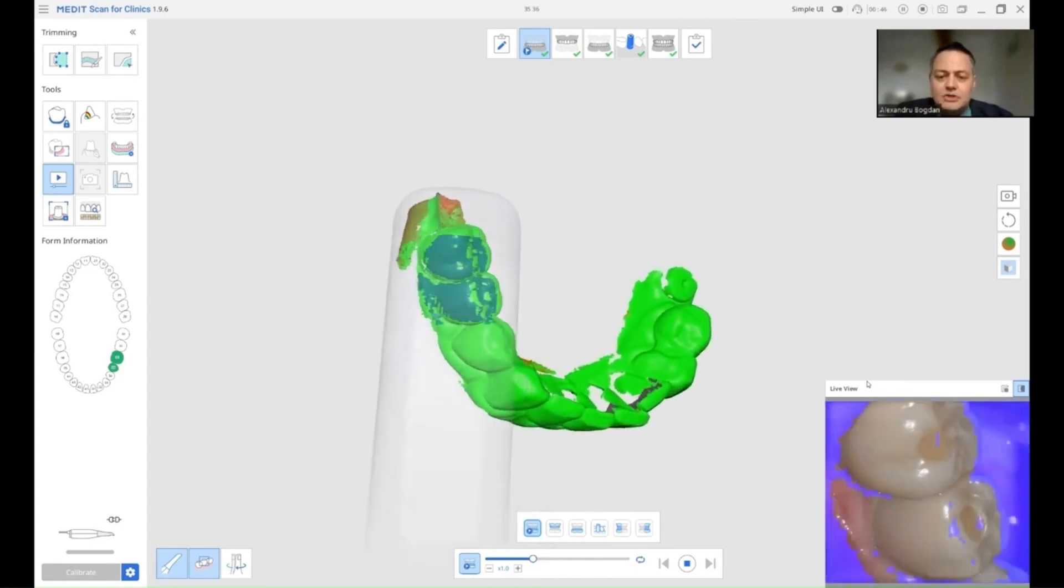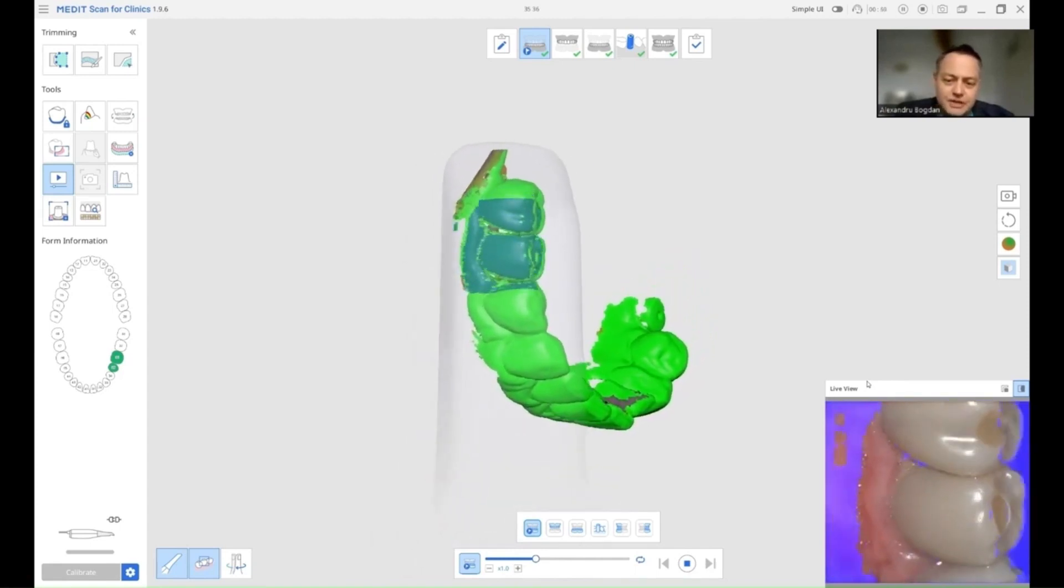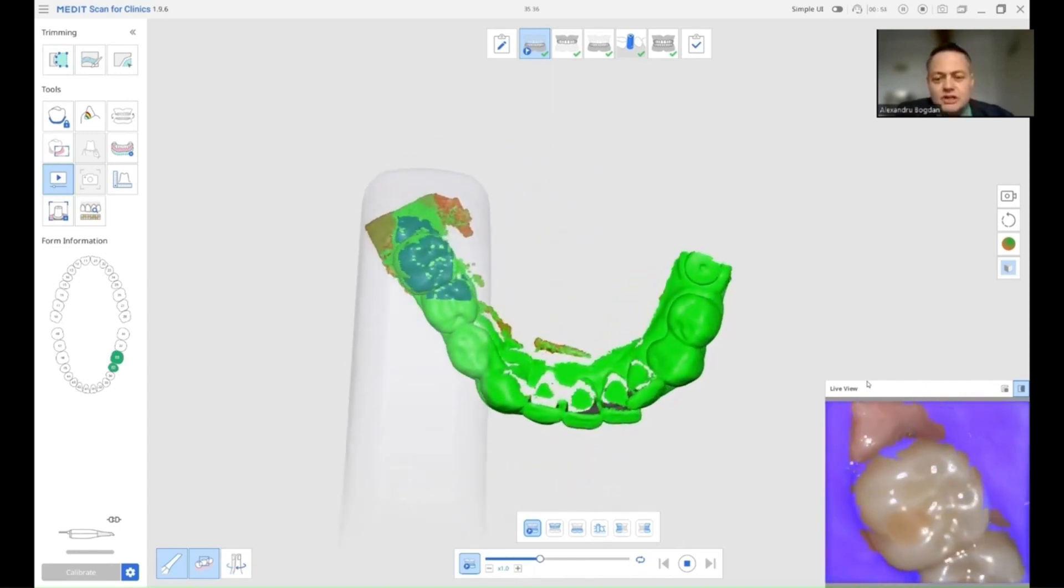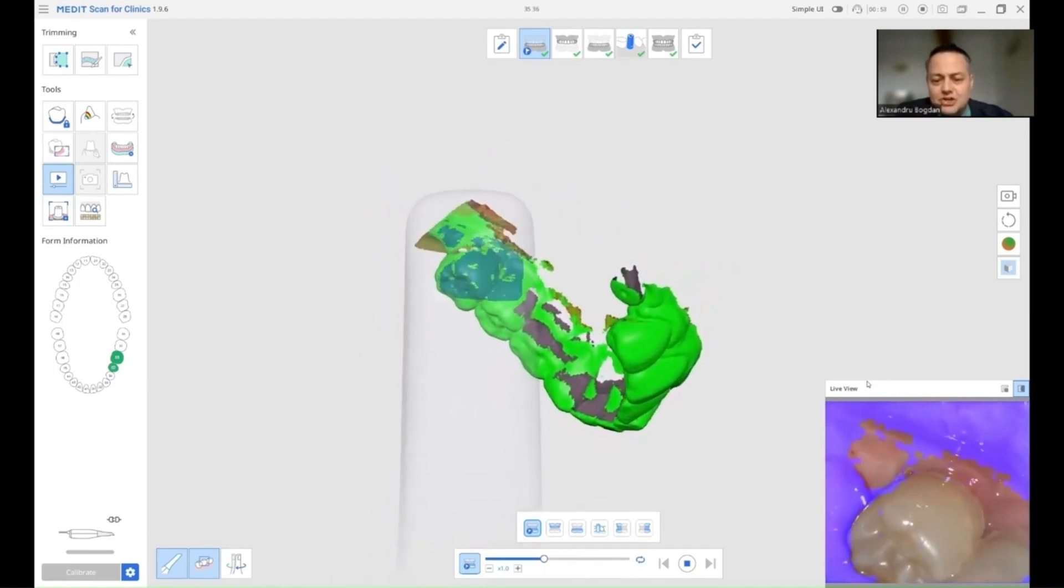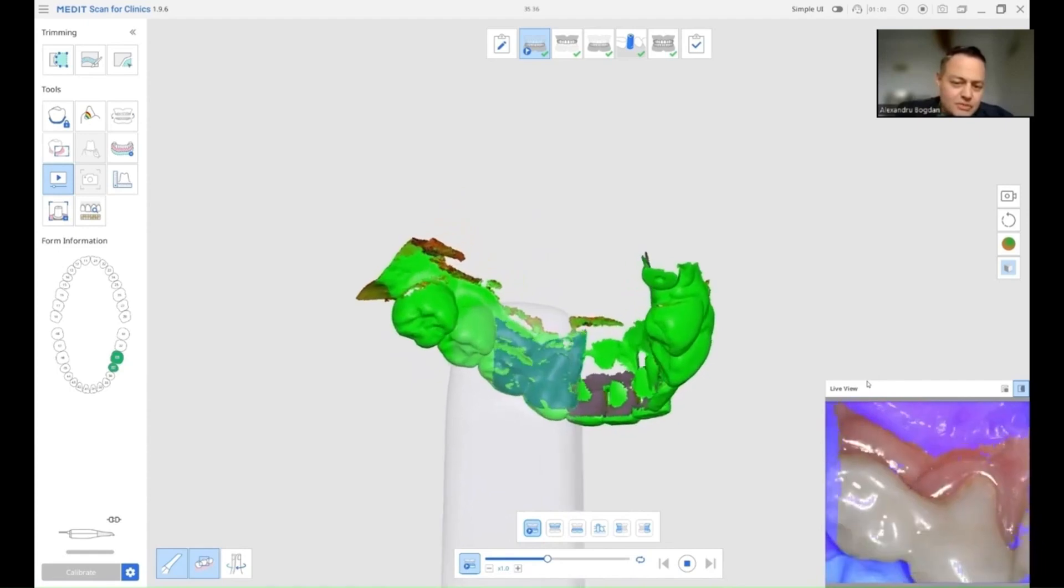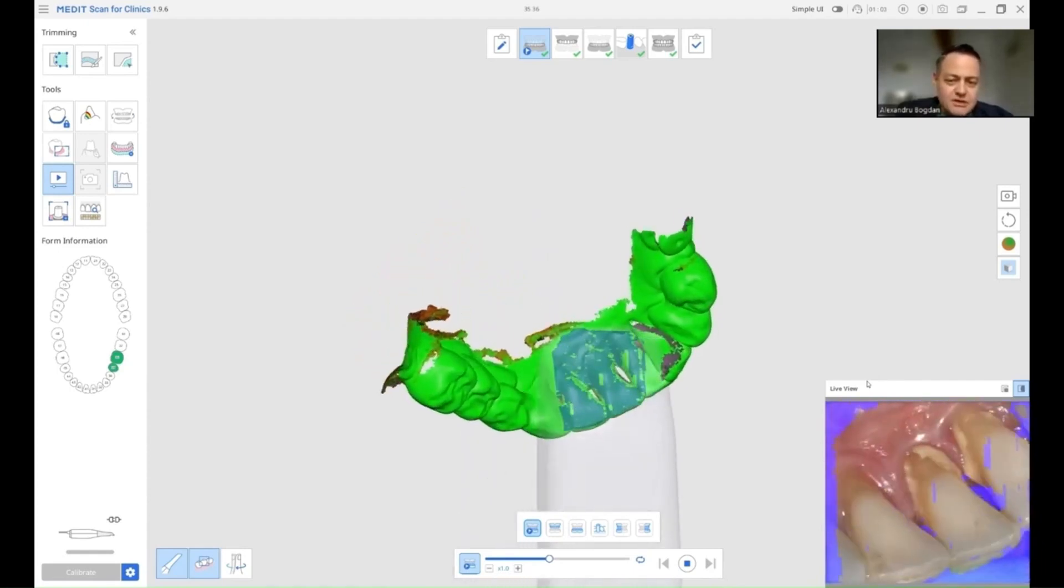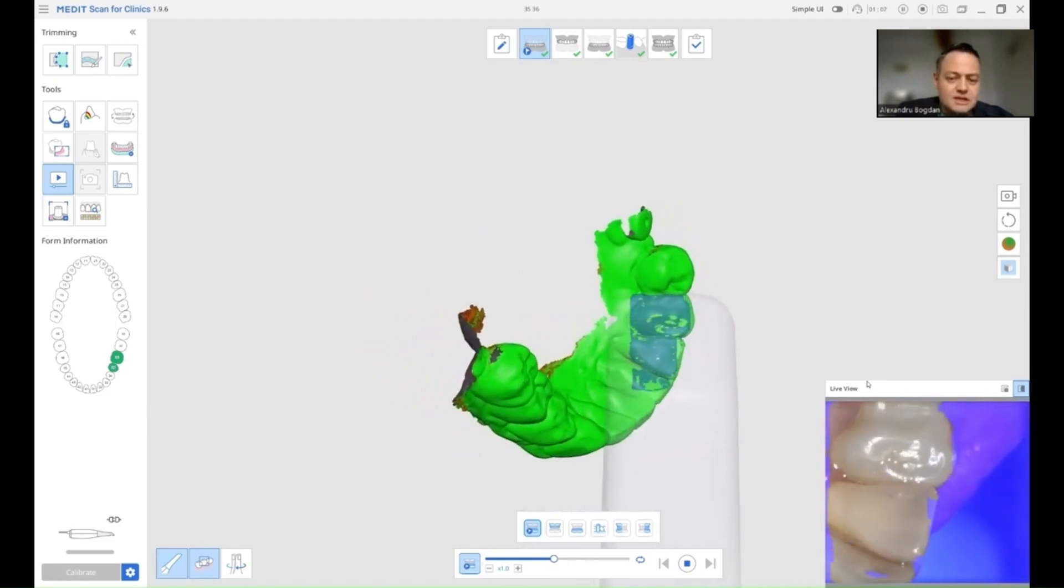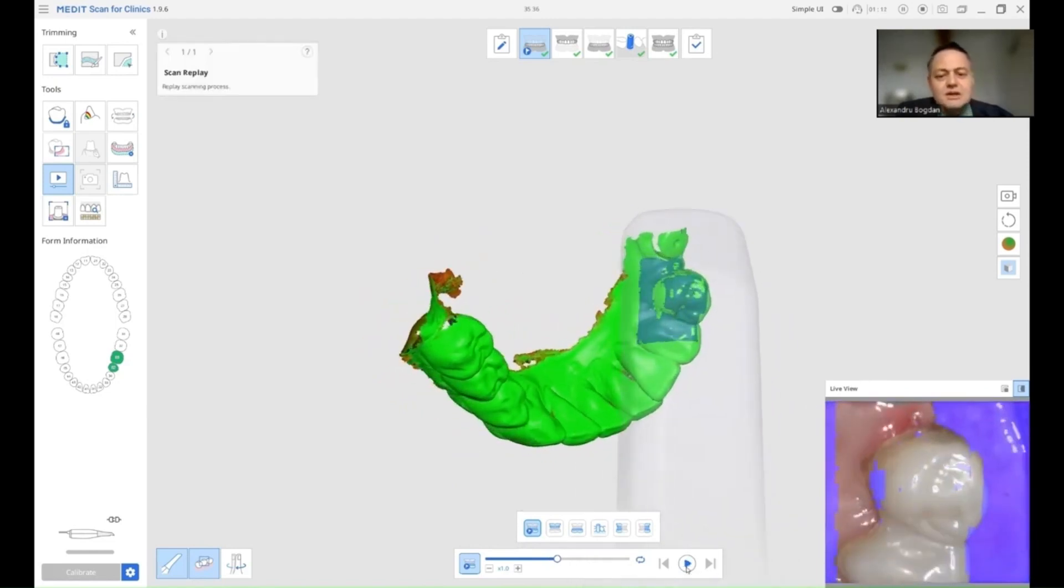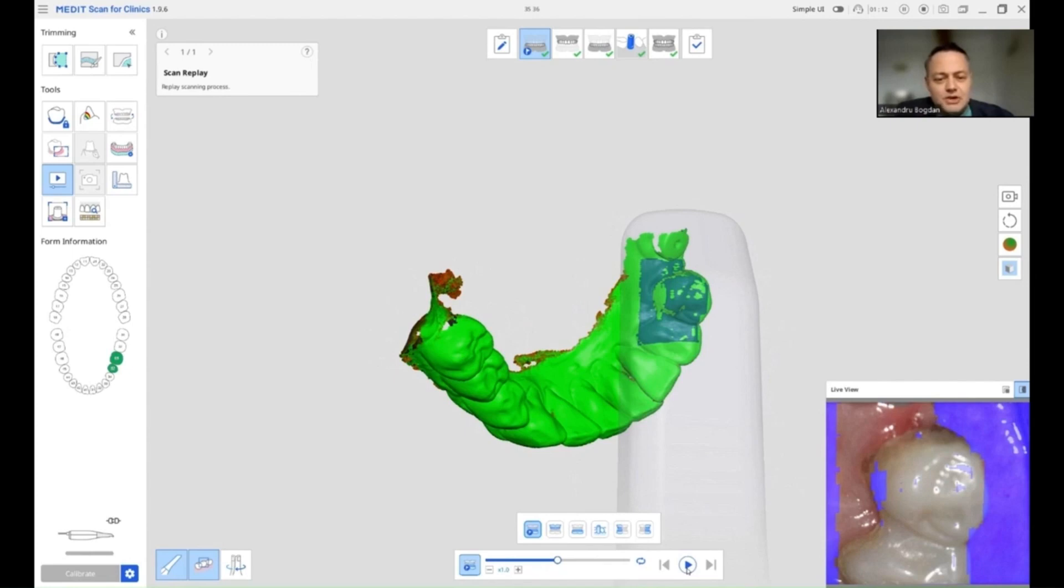I am adding information between the incisal scan and the fixed gingiva scan that I already did. As you can see, my whole scan is green. I do stress upon having information green everywhere and please scan your cases in reliability mode for as long as you feel that you are not very in control of scans.